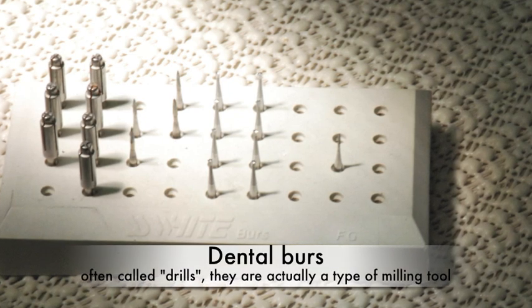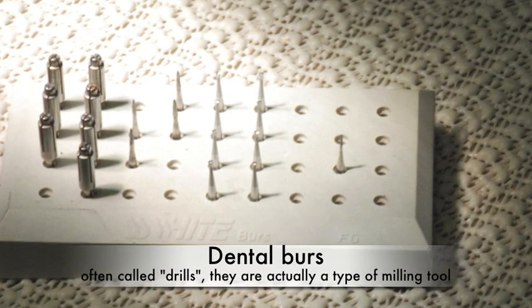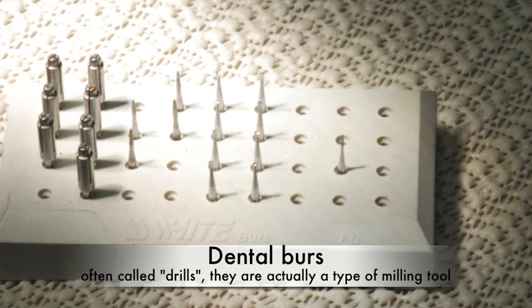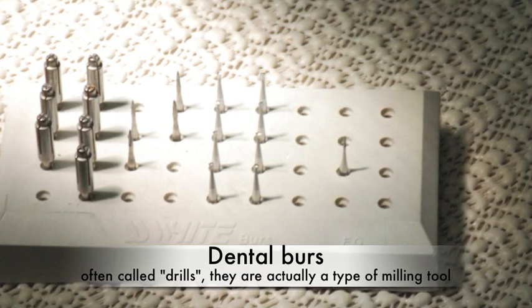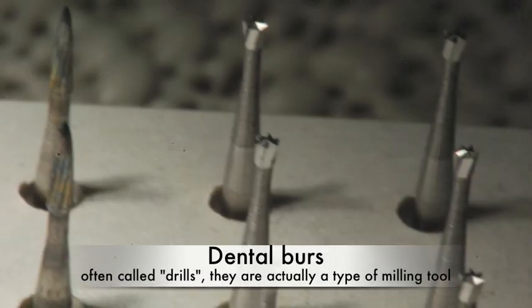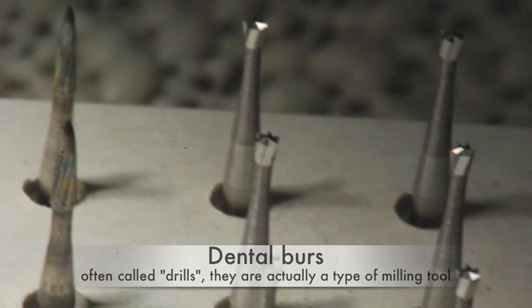There are dozens and dozens of different burrs, and each one has a different role to play in the provision of dental care. In general, they are used to cut tooth structure and restorative materials, whether in the mouth or outside the mouth, such as trimming, adjusting, and polishing dentures.